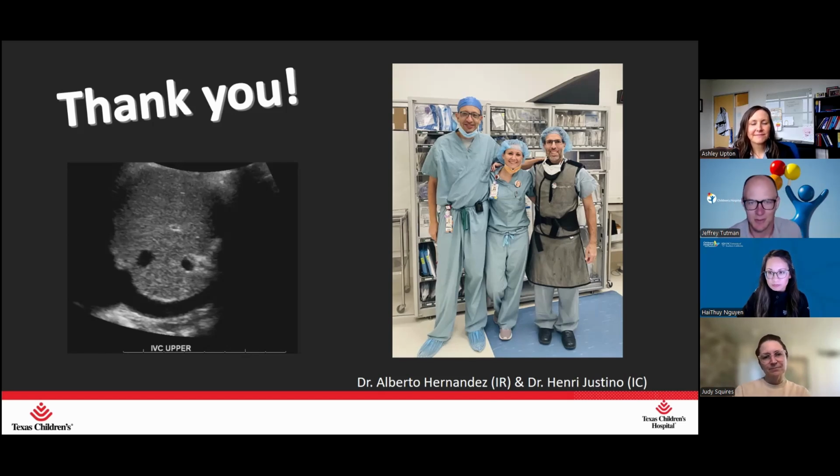Yeah, I think it's definitely interesting. I'm not sure what you guys are using for your normal values, even for your Fontan patients, but what we use is that SRU white paper that was published a couple years ago. We give the kPa just as a straight number, and then we include a disclaimer with some of the verbiage from that paper. There are so many variables, like if you have cholestasis or inflammation or obstruction within the liver, that can confound those values.